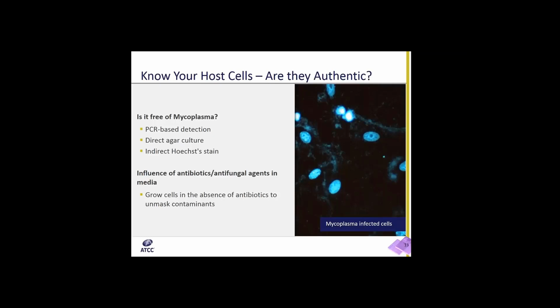Finally, I have to mention the influence of antibiotics and antifungal agents in media, which is a common practice in many labs. Our practice is to grow the cells in the absence of antibiotics because this will help us unmask the contaminants.